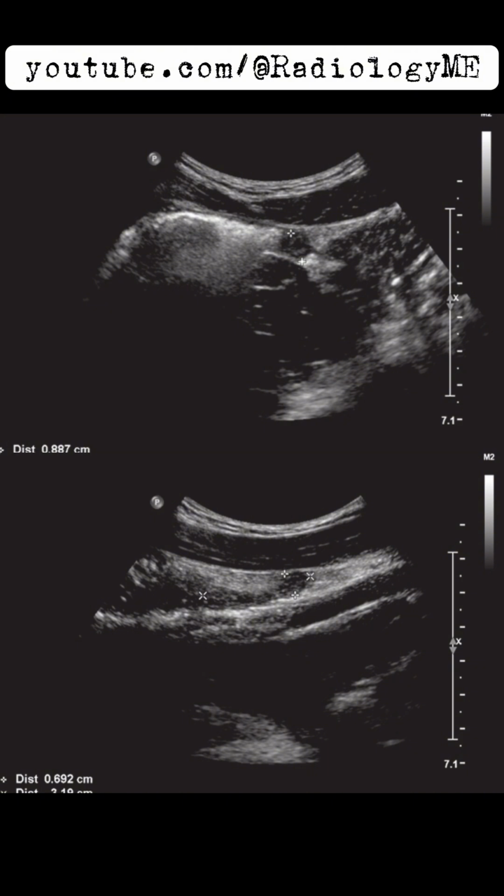When I examine the cross-sectional view of the appendix, it's important to note that the appendix exceeds the normal diameter of 6 millimeters, which is a key positive finding. This makes appendicitis the most likely diagnosis.